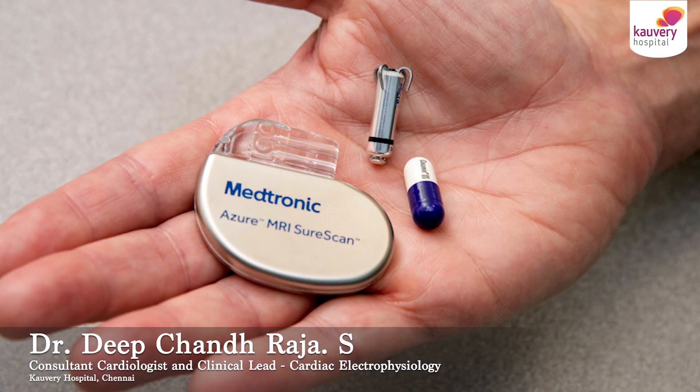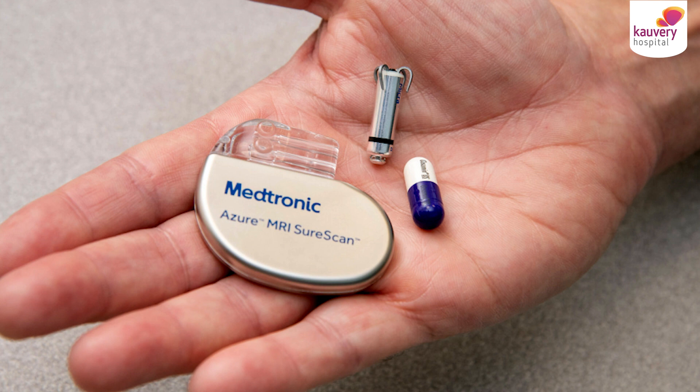What is a leadless pacemaker? What is a pacemaker first of all? Who are the patients who need a pacemaker? There are patients where heart rate can slow down, and that's because the heart has electrical wires within. There could be a break in these electrical wires which can slow down the heart rate. These are the patients who might need a pacemaker.